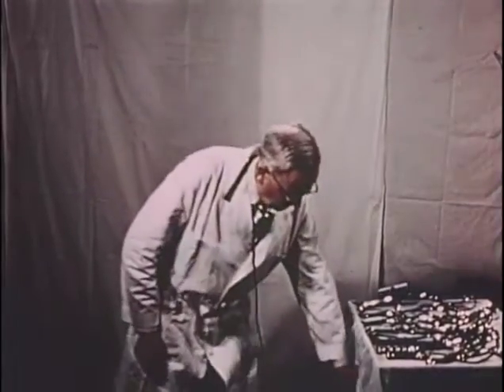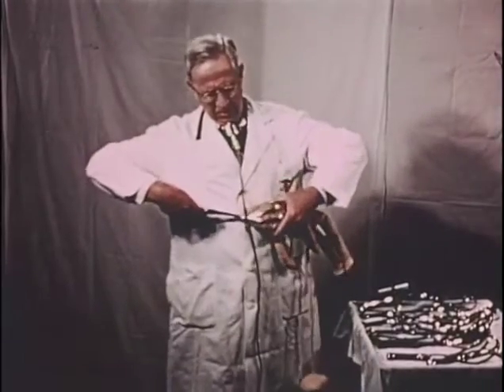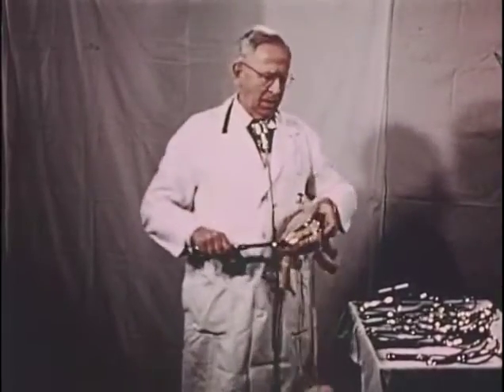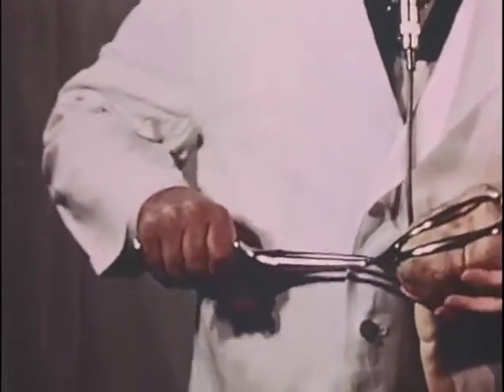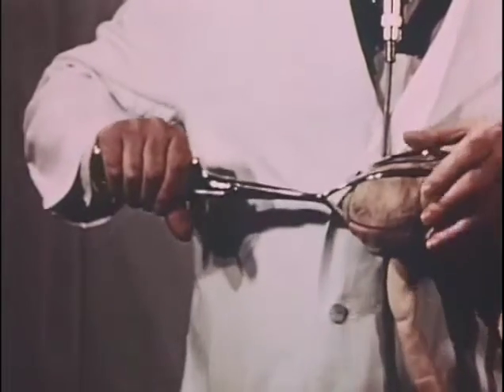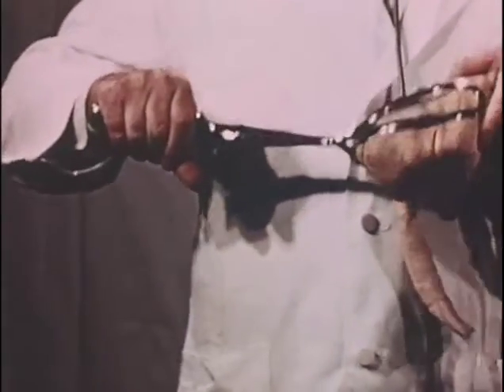This can be demonstrated on the fetus. Here we have the blade lying along the side of the head, extending from the parietal boss to and beyond the malar eminence, filling the space between the orbit and the ear symmetrically without pressure points.